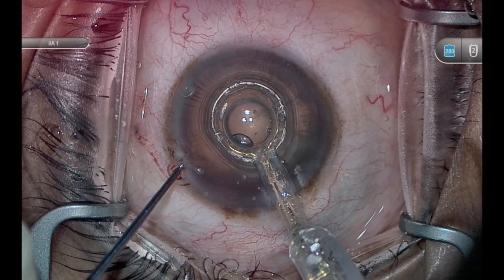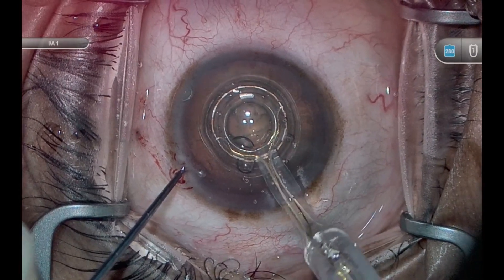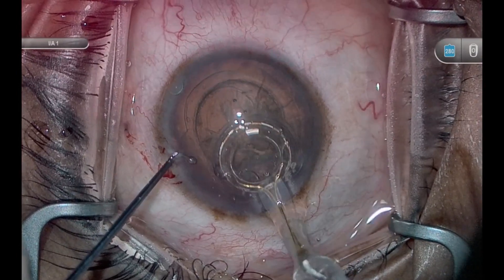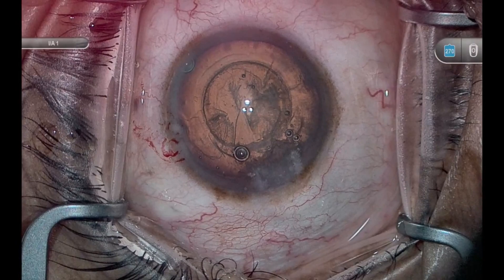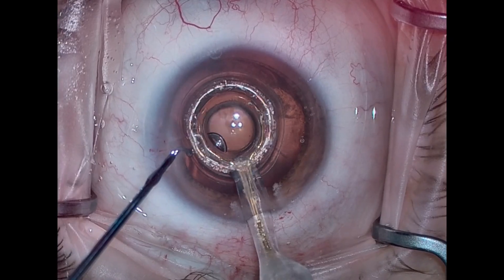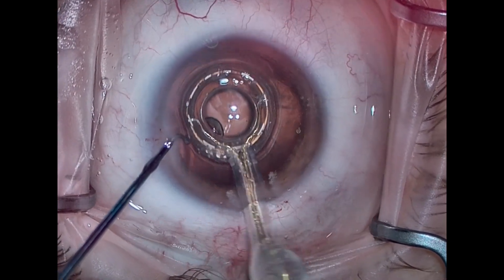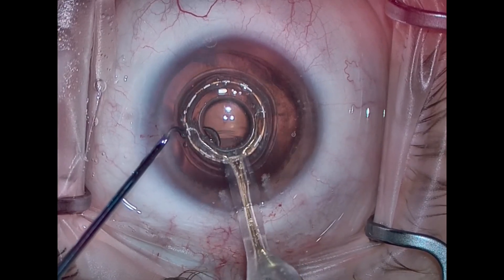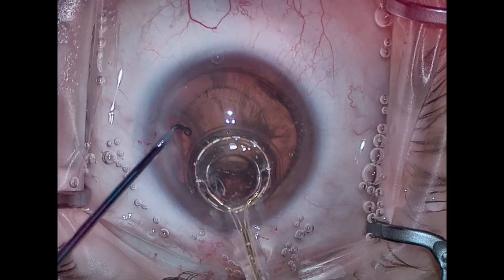Once Zeptoe is complete, there will be a flush of BSS that will allow it to release from the anterior capsule. Most times, it does it just fine. I like to wiggle the tip around a little bit — I push forward side to side just a bit — just to verify that the Zeptoe has been released. Once it's verified, I go ahead and remove it from the eye. Sometimes, there's not a really good gush of BSS. In those cases, you can hit the reflux button on your phaco pedal — that'll help release it — wiggle it around a little bit, make sure it's released, and go ahead and remove it from the eye.